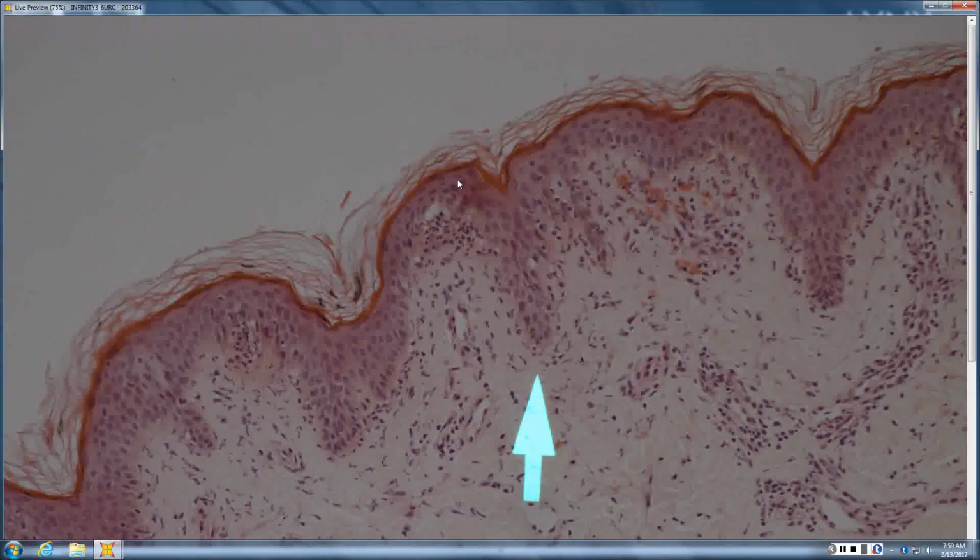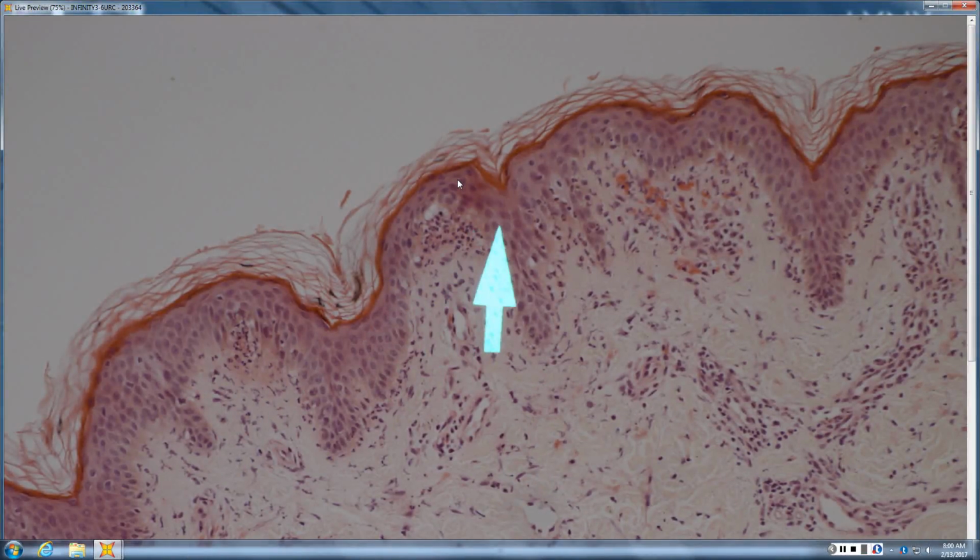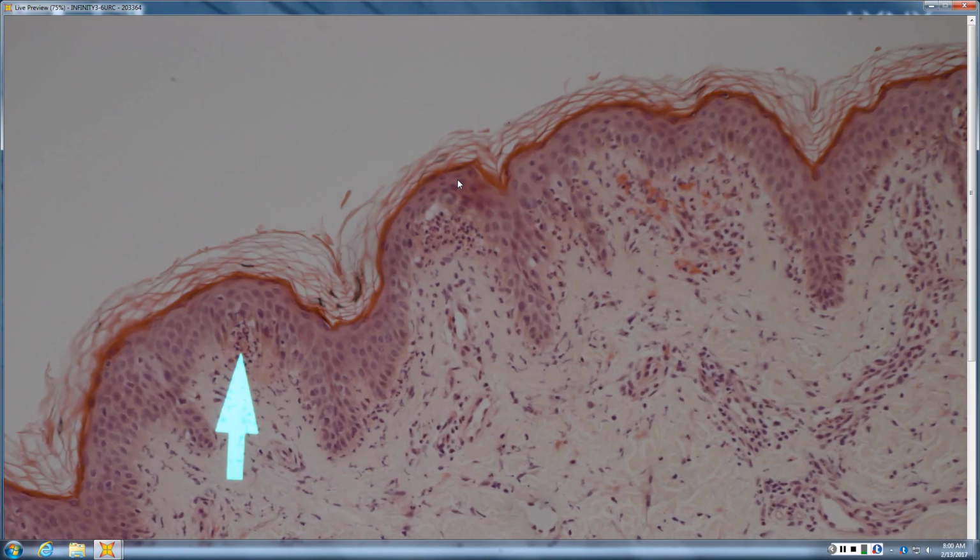So, pretty nice basket weave orthokeratosis. You've got some neutrophils collecting in the dermal papilla, some extravasated reds. Be worried about DH, linear IgA. Yeah. So there are areas where the neutrophils line up along the DE junction, like there was maybe linear immunoglobulin, and some areas where they cluster in the dermal papillae, as if there were granular immunoglobulin with a picket fence pattern in the papillae. So this one can't decide what it wants to do by pattern.